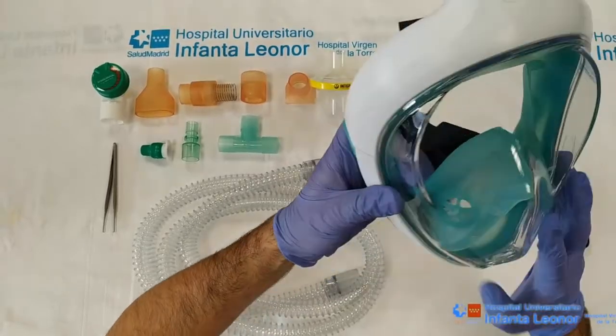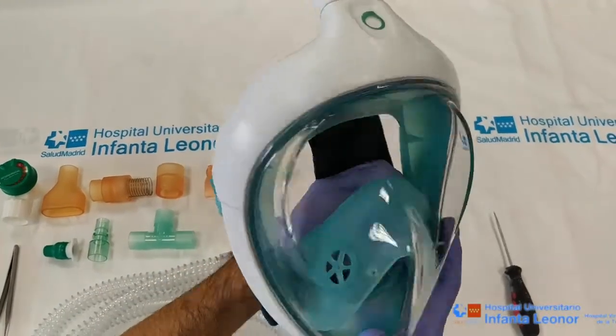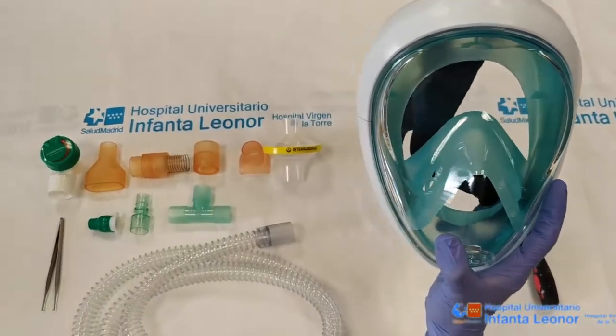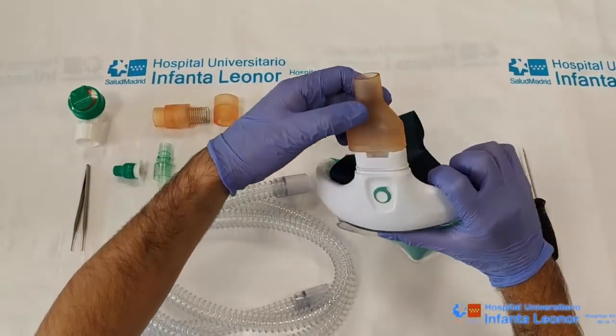Next, we move inside the mask to remove both internal membranes from the nasal section, which we will later need. We position the adapted top piece on the exit point.